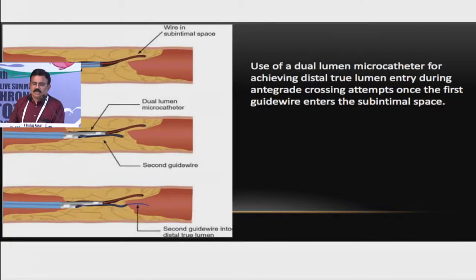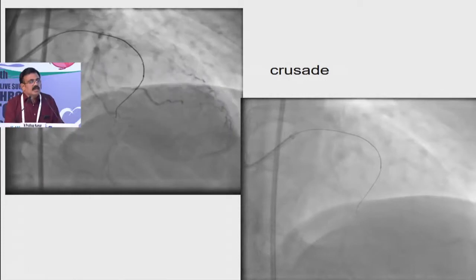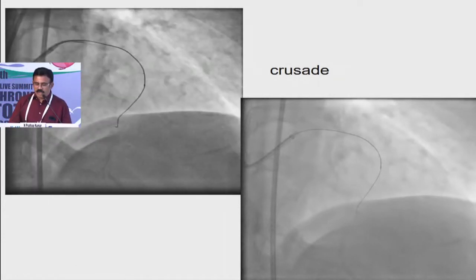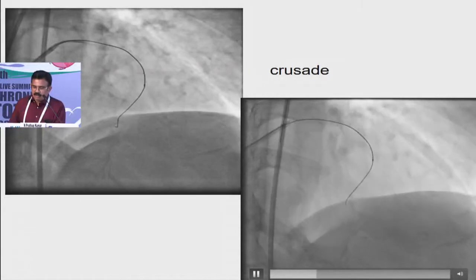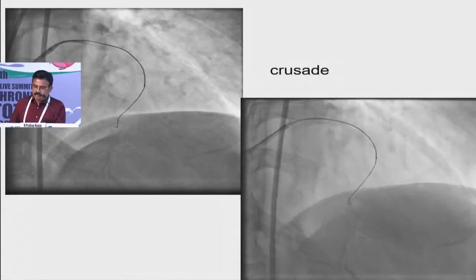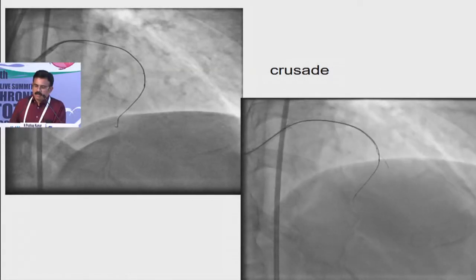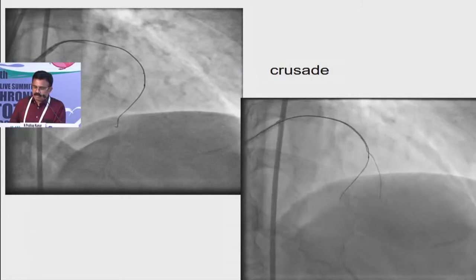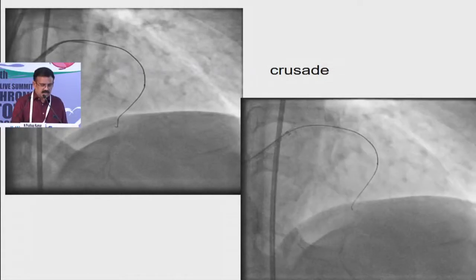Use of a dual lumen catheter for achieving a distal true lumen entry during antegrade crossing attempts once the first guide wire enters a subintimal tract. Here the wire enters into the septal artery. I tried with a second wire. Actually, this is a Crusade sitting there. Through the Crusade, I'm taking a second wire. The wire enters, and this is another use of a Crusade catheter, which takes a second wire.